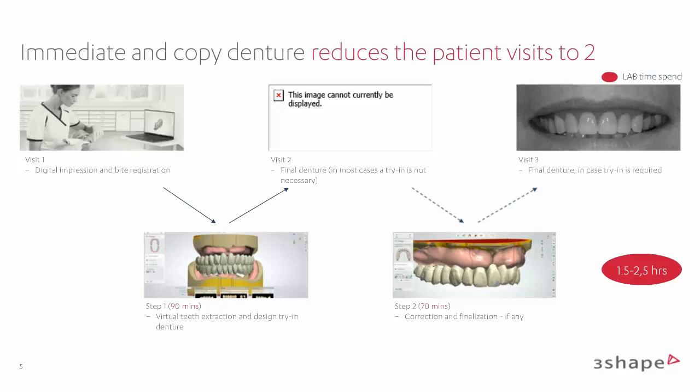So the value proposition, in my opinion, and Esther and I believe Tanya and other people that are already applying digital here can truly agree to this, is that there are tremendous workflow savings on this workflow.